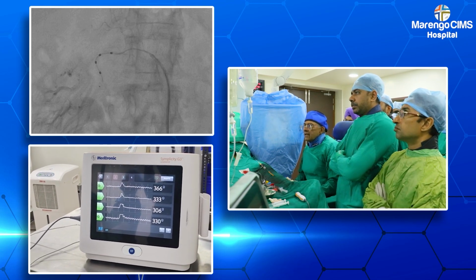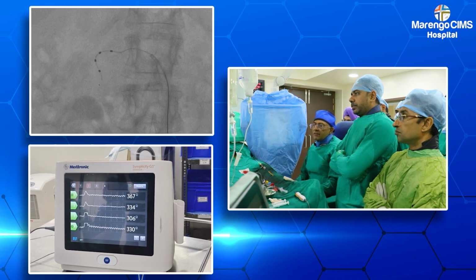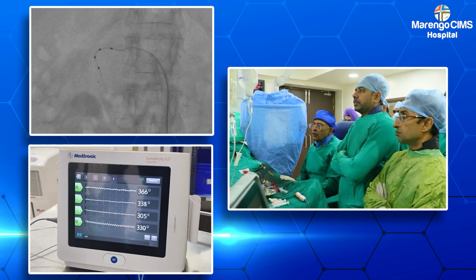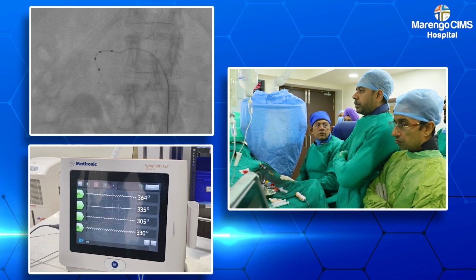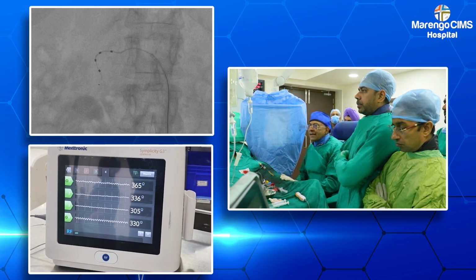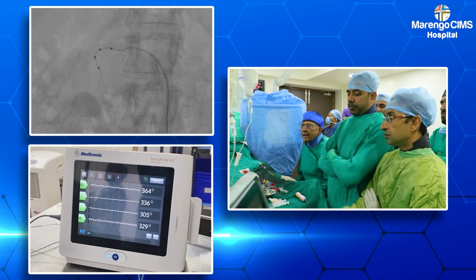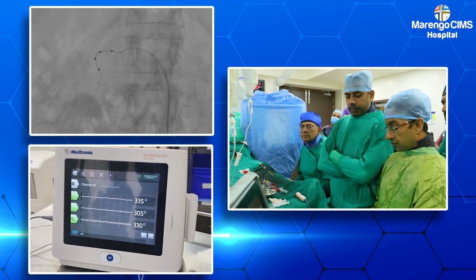So freeze here. Let's see 4 or 5 views earlier when we did the ablation in that scenario. As you see, the concertina effect or the spasm is gone away. So I think we are now in the right position for the ablation of a single electrode number 2. Vipul, yes, please go ahead. 60 seconds, switch off first, third and fourth electrode.